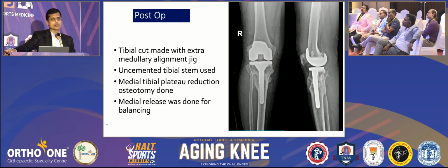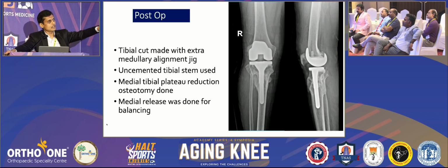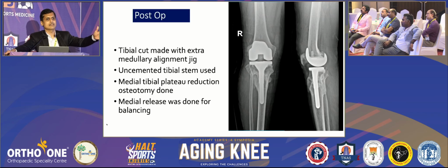Even though extra-articular correction has not been done, with just a simple intra-articular correction, the alignment has come to this level. So that is what the preoperative planning does. Just because it is an extra-articular deformity, we need not go and do a two-stage procedure or anything.